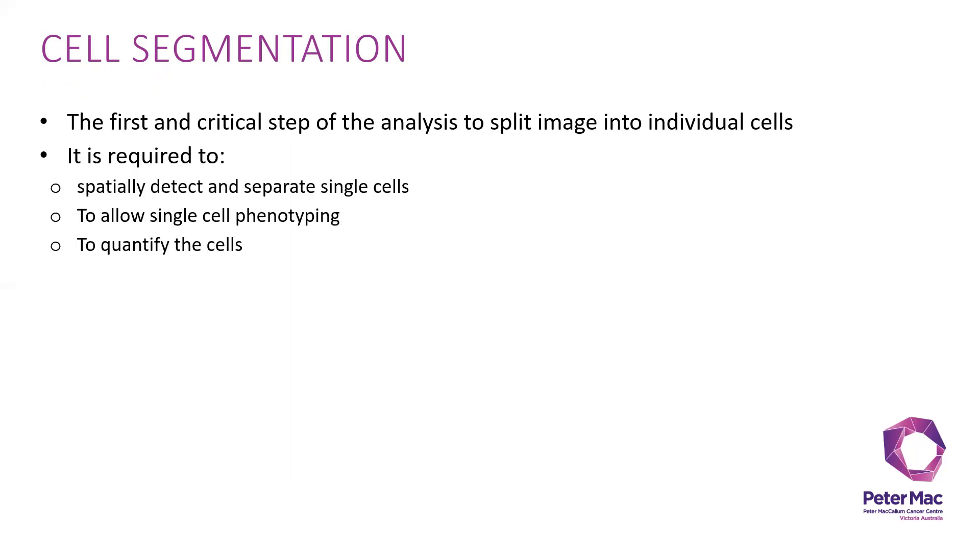It is required to spatially detect and separate single cells to allow single cell phenotyping and to quantify the cells. Cell segmentation on HALO relies on nuclear, cytoplasm, and membrane detection. Let's move on to nuclear detection.